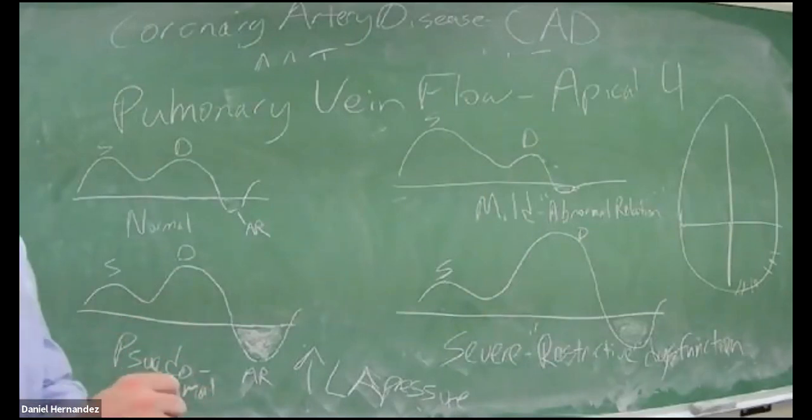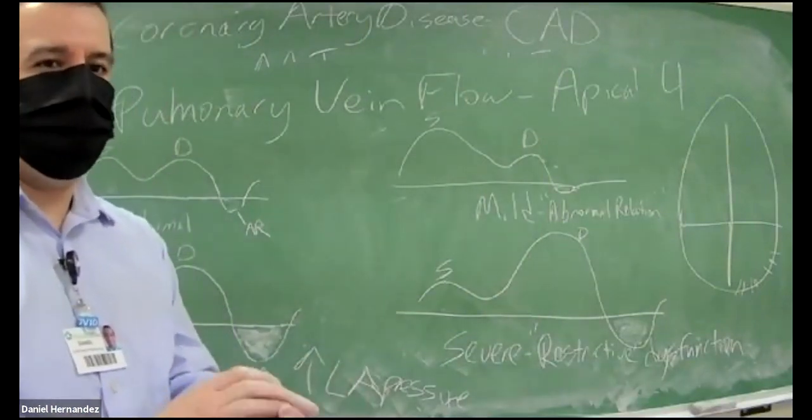So is there any measurements or we just eyeball it on the waveform? No, we're not measuring it. We're just obtaining a waveform. We're just Dopplering and getting a waveform for the doctor.